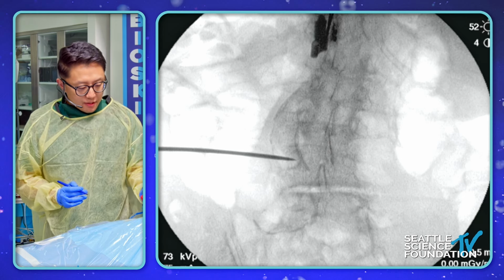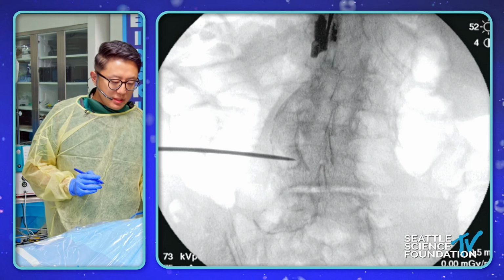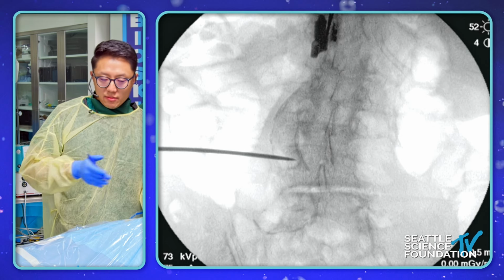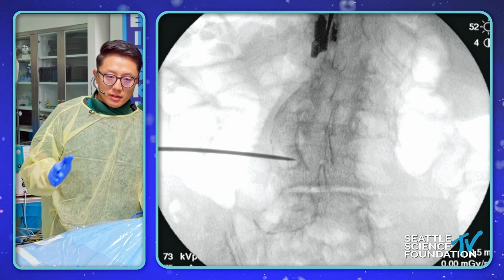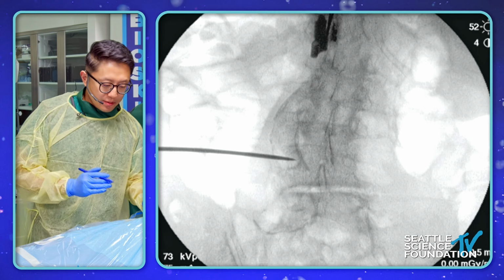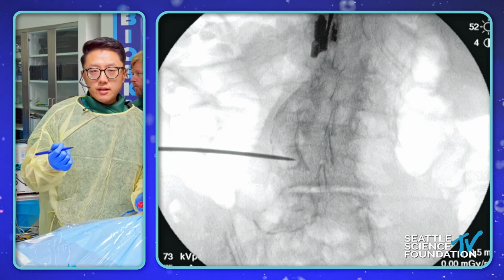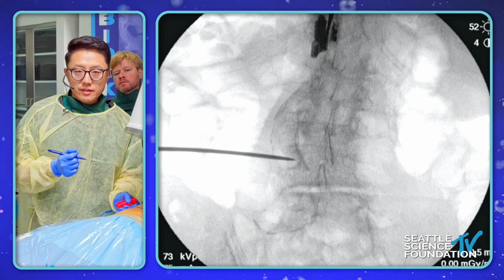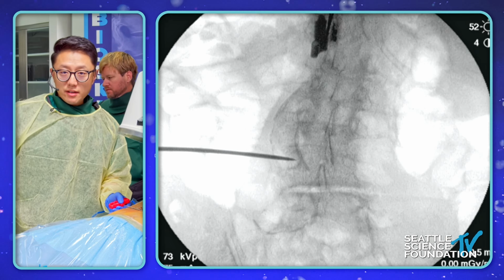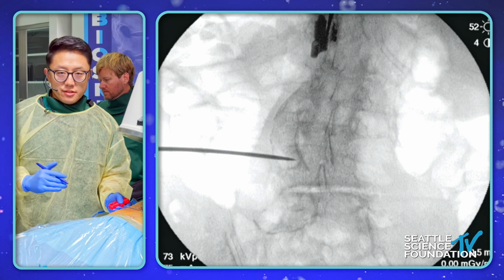So as far as migrated disc herniations, I find that typically, we normally take a cranial to caudal trajectory. And so when we do that, we can easily take off the top of the pedicle below, and it's really just maybe 2 or 3 millimeters. So it's not like you're destabilizing the pedicle. But that allows you to really look around the corner, and then with the angled instruments, you can grab those down migrated disc herniations, even down to nearly the level below. So we're talking about zone 3, zone 4 migrations you can access.